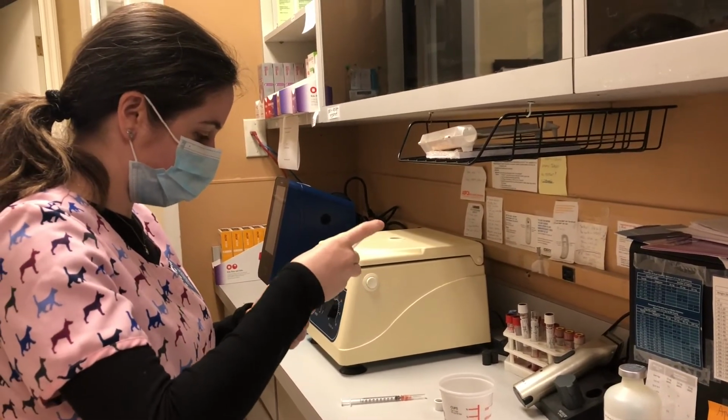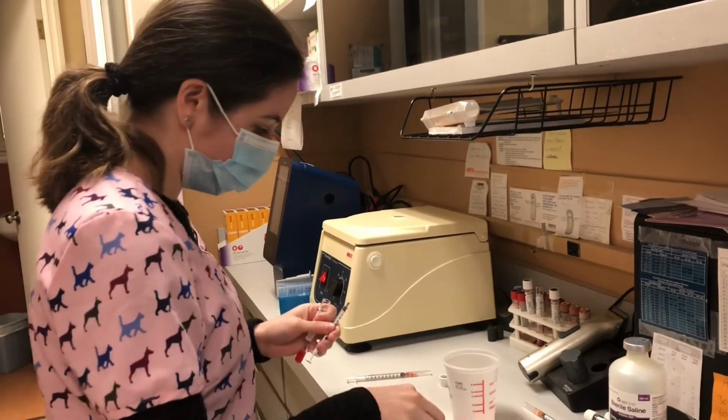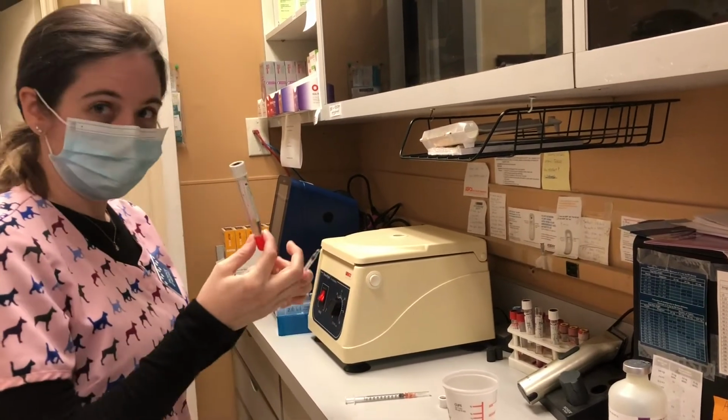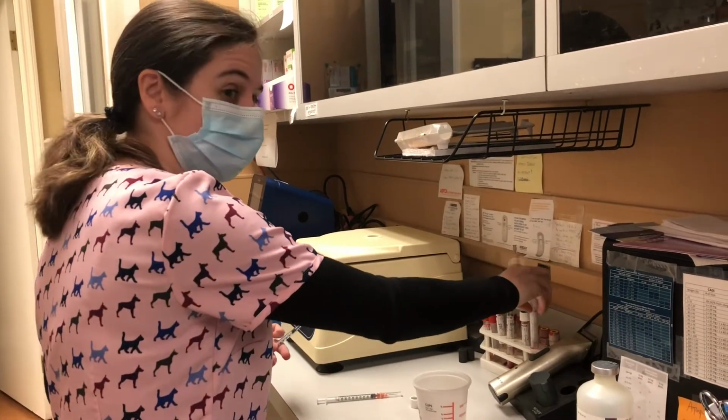Then I'm going to mix that together. I'll put this to the side and do the same thing for my donor cell suspension as well.